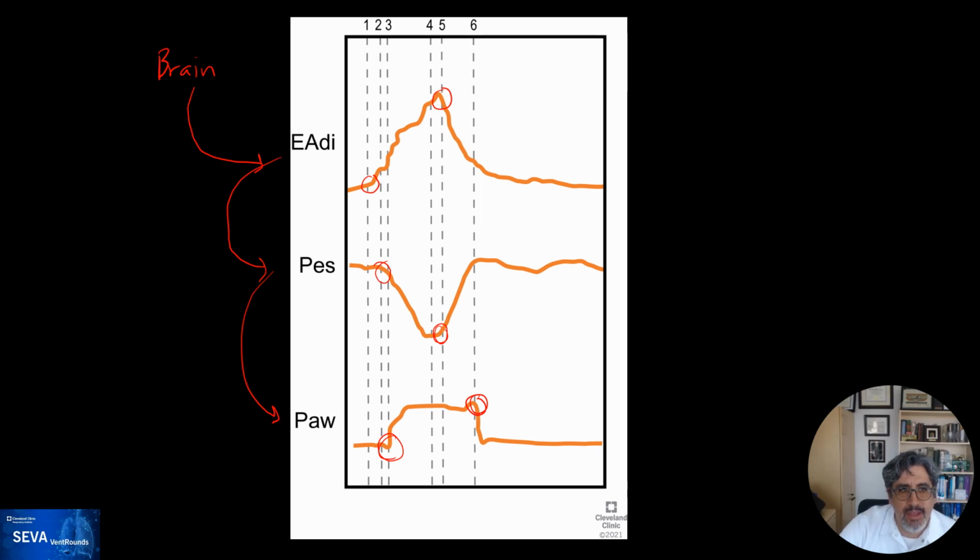And the same, the difference between the peak on the electrical activity and then the end of the breath over here. So that's a much more finer way of measuring differences, but also if you're controlling the ventilator, and now instead of having to cause all the changes on airway pressure and in the pleural pressure and then on the airway pressure, you can imagine that it would be more responsive and that synchrony lag would be gone.